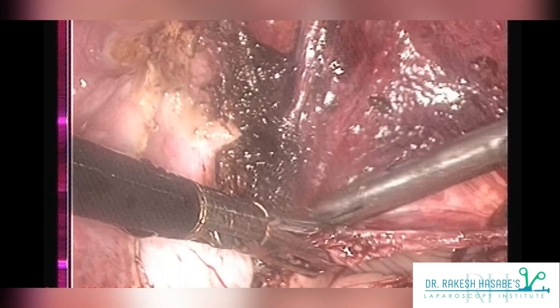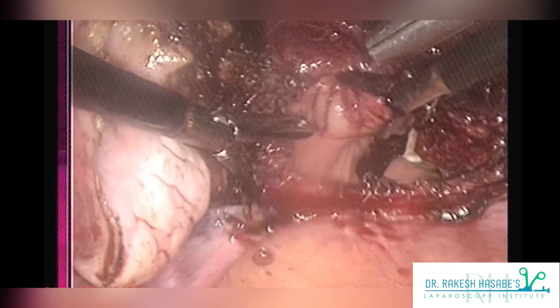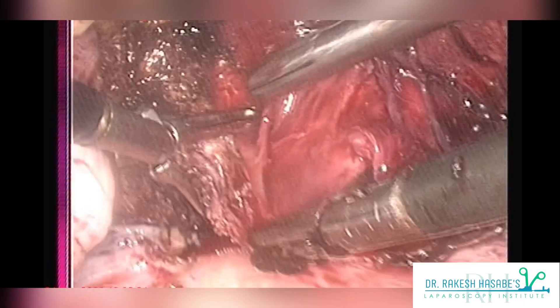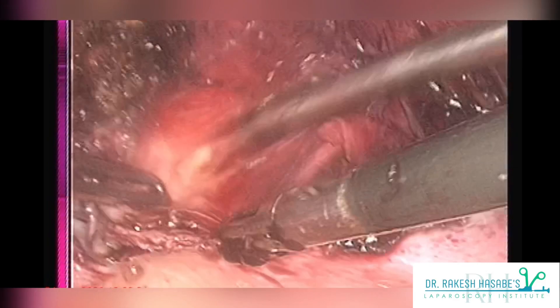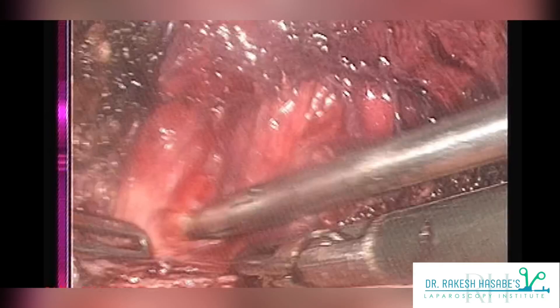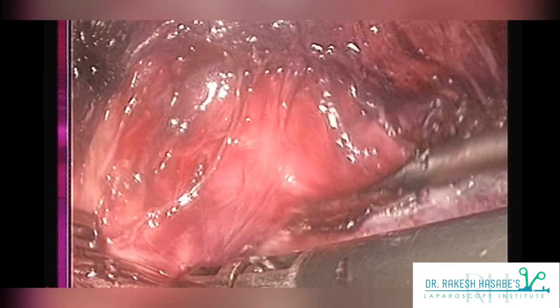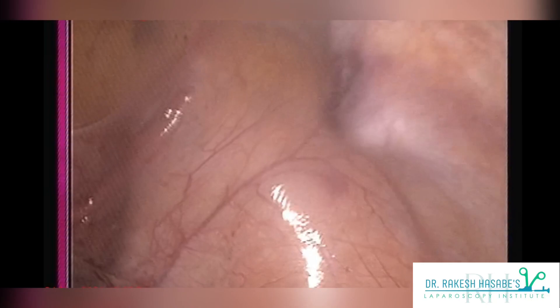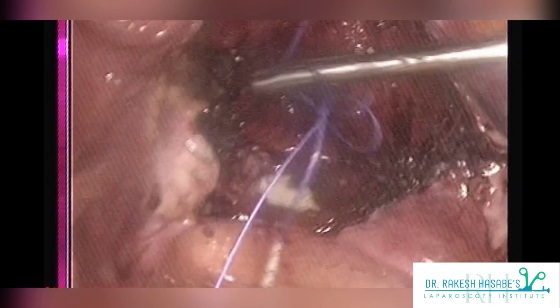There are two or three ways of inserting your thread along with the needle inside the abdominal cavity. People use the vaginal route to introduce it, but that has a theoretical risk of carrying vaginal infection into the peritoneal cavity. I would always prefer putting it through one of my ports. I have one 10mm port and other 5mm ports. The needle along with thread can be easily passed inside the abdominal cavity through a 5mm port, or if you are not well versed with this, you can always insert it through the 10mm camera port.